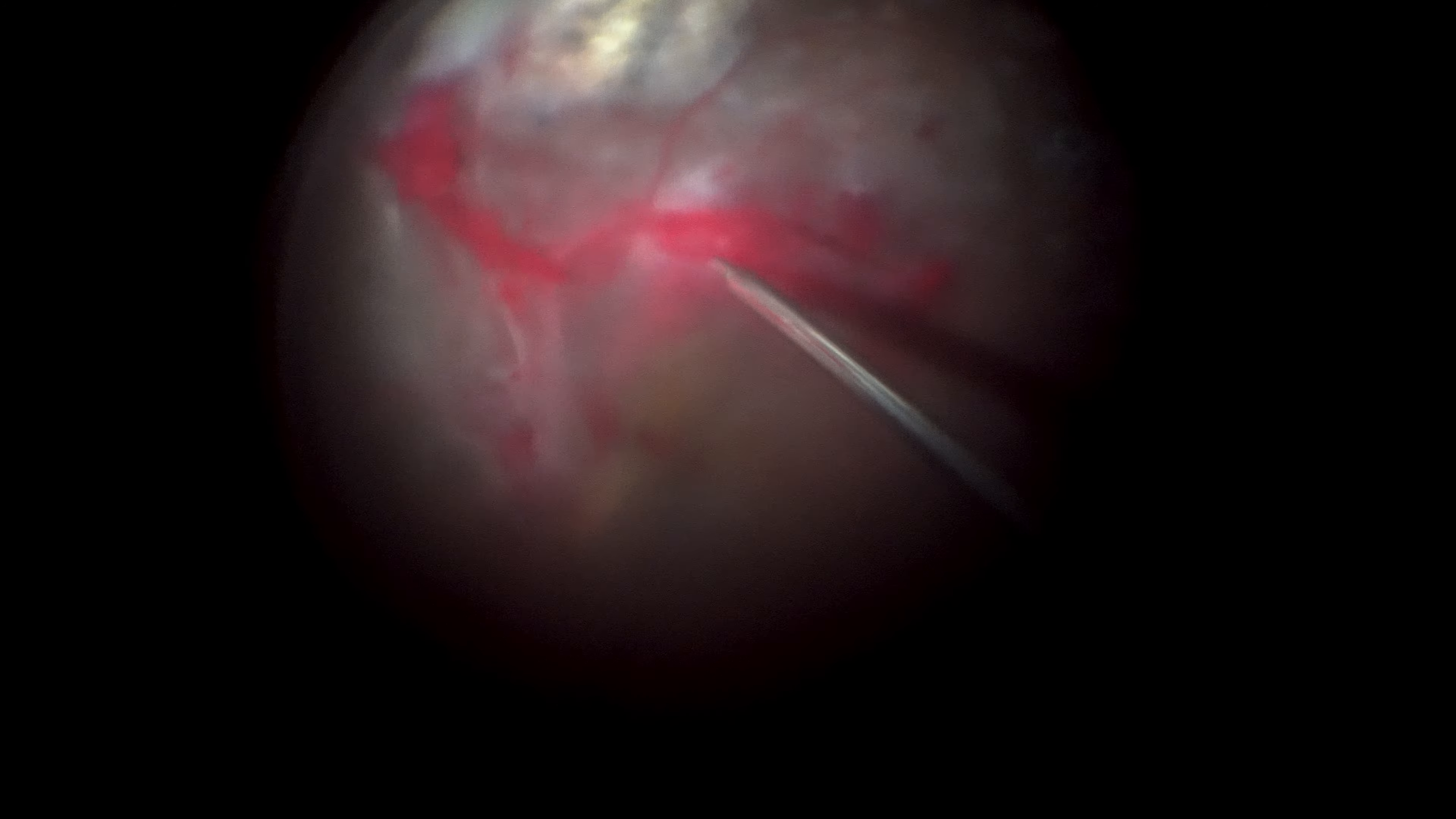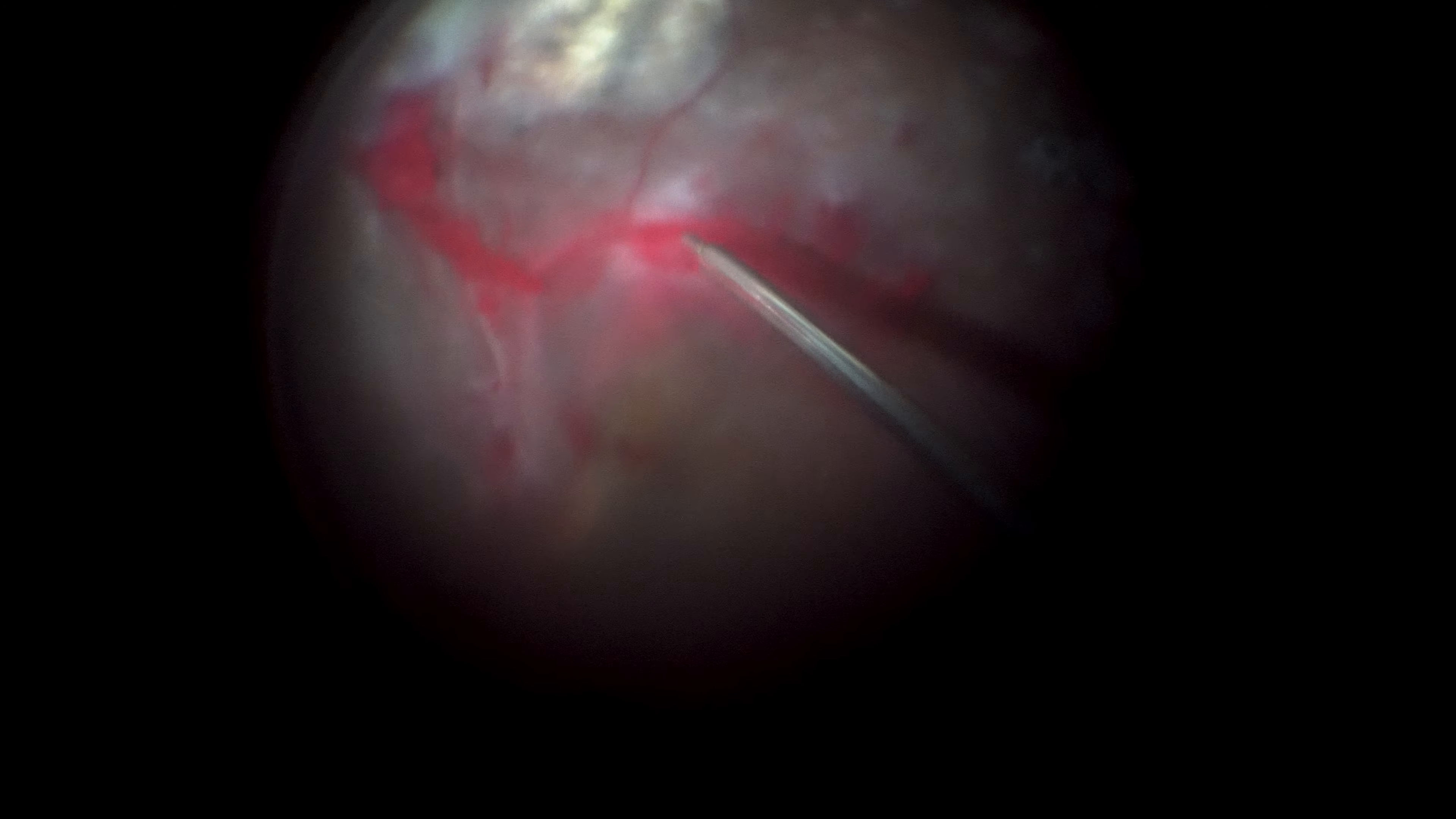By zooming in on the retina, it is possible to get a closer view and better appreciate peripheral detachment and traction with dense fibrous tissue.